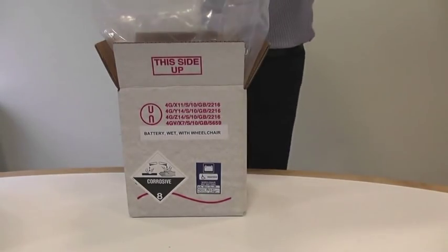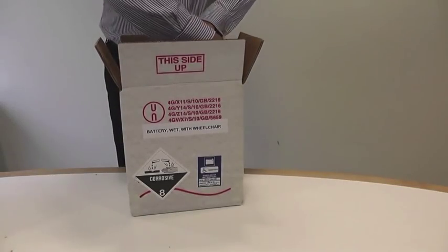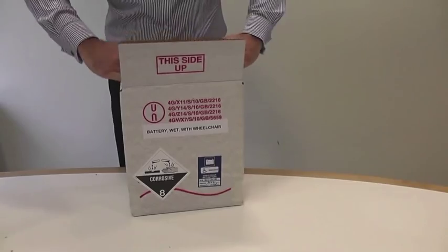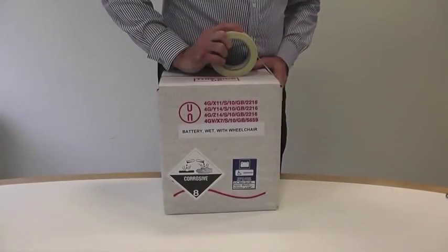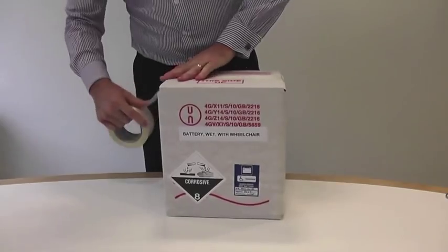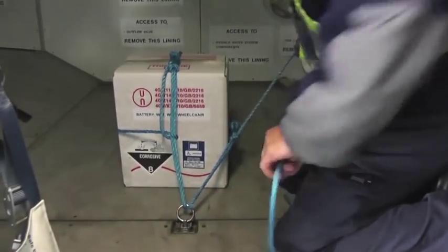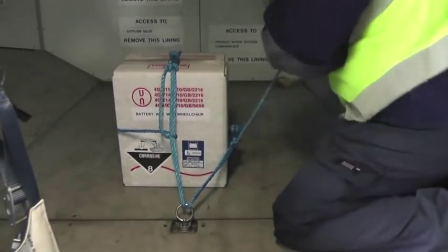Mobility aids with spillable batteries must be loaded and kept upright at all times. However, if this is not possible — perhaps because of the height of the hold ceiling — batteries must be removed and packed in strong leak-proof packagings with enough absorbent material to absorb all of the acid should it leak. The package must bear a corrosive hazard warning label.